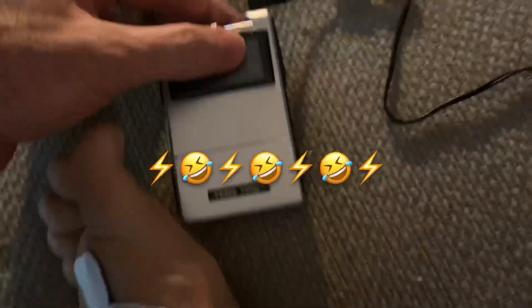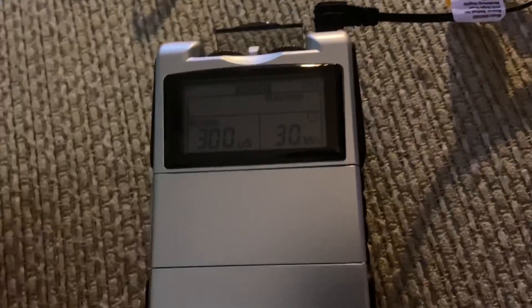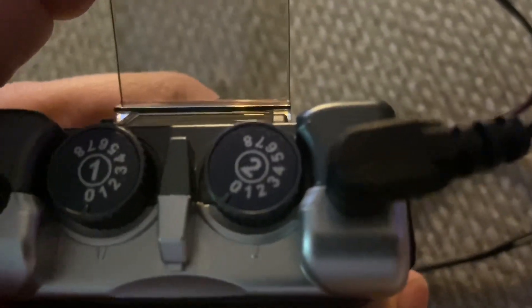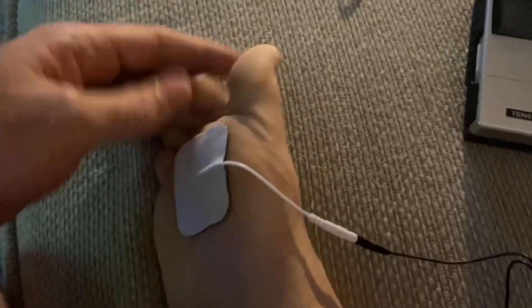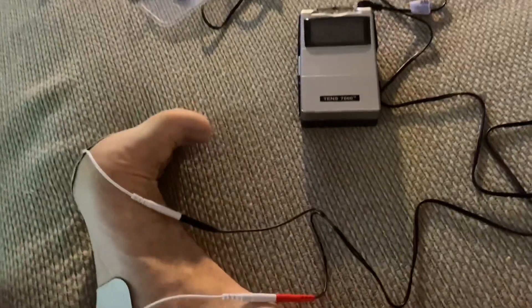Oh gosh! I turned it up way too much. I barely even needed to turn it up — I turned it up to maybe three and wow. I don't know if you saw that, I don't know if I captured it, but wow.